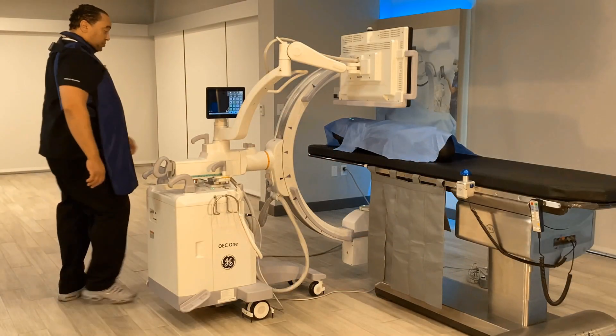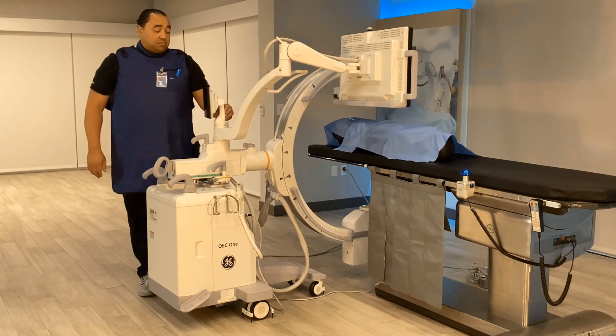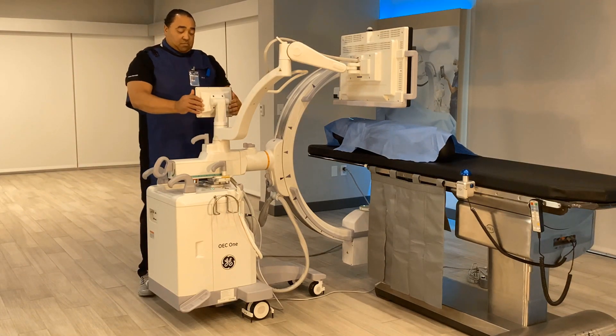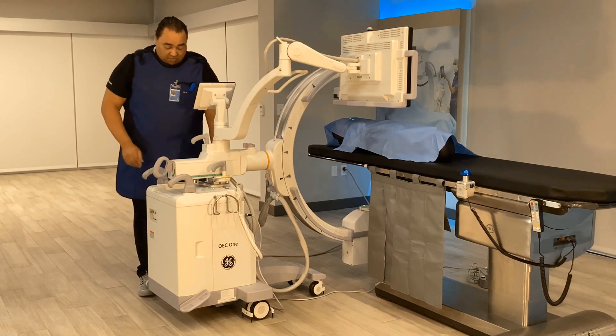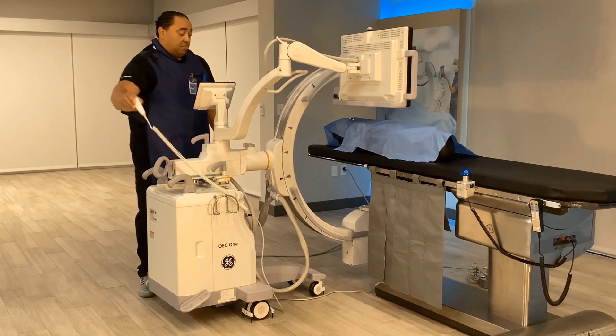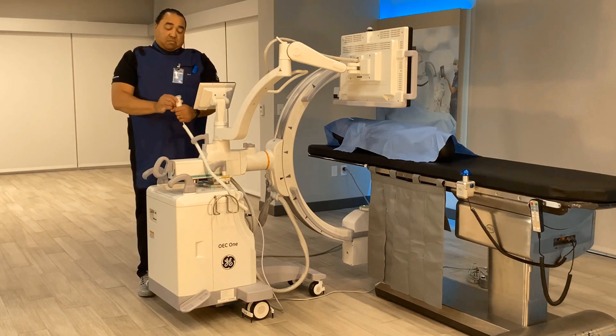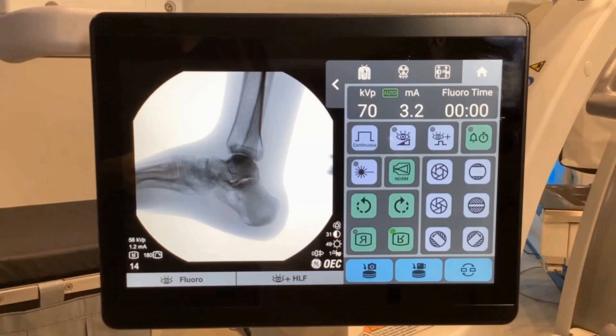Hello, my name is Kevin Holland. I am a clinical imaging specialist for GE Healthcare. And my name is Allison Cook. This video will review basic usage of the OEC1 CFD touch control panel.